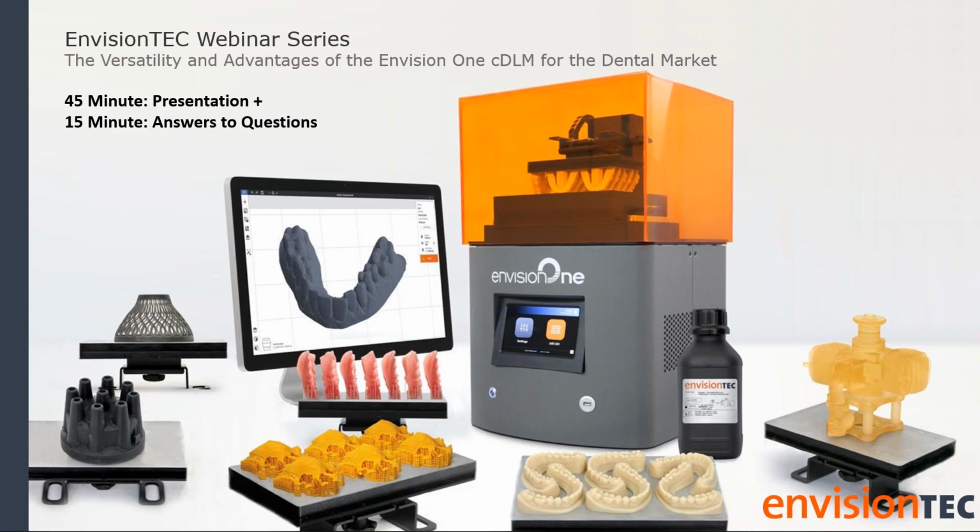And then also just to add to that, there are post-processing methods. If you do have a matte finish model, for example, if you print a matte finish model on the E-Model Light and you do a polish with pumice, you're actually able to get a really nice glossy surface finish.